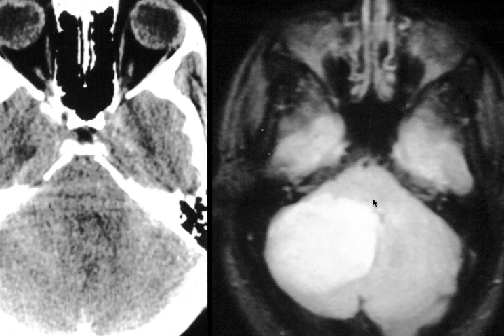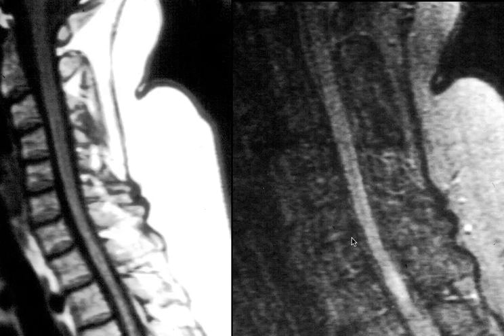And this is a CT and an old MR scan from the 1980s showing this big tumor that we've already seen before. Very subtle, if at all, seen on an old CT scan, and we can see it very nicely on an MR scan. Here again are old studies, and I've kept these in just to remind people of what we started with back in the 1980s.